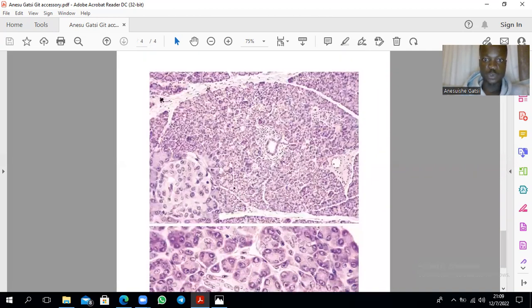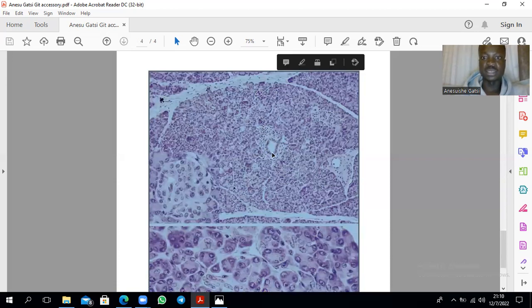Then this is pancreatic tissue. Like I said earlier, when I'll show you an intralobular duct, this is an intralobular duct. Right, that's a blood vessel. Right, this is connective tissue, the septa that divides it into lobules. That's connective tissue. These lightly stained regions here, those are islets of Langerhans. And the rest, this is acinar tissue. Right. Where you find the islets of Langerhans, there should be a blood vessel close, right? Because endocrine organs secrete into the blood.